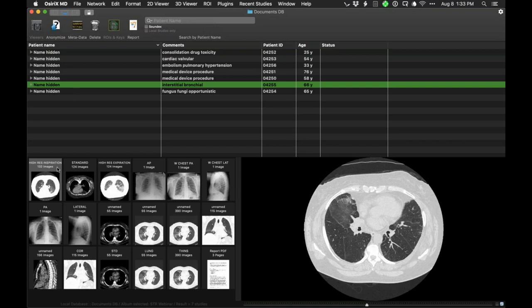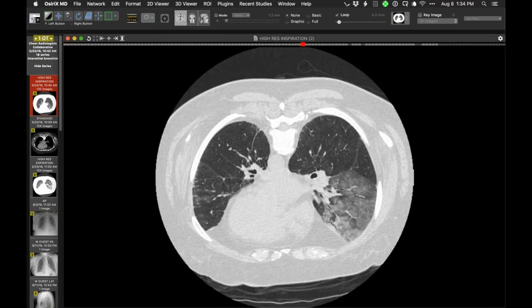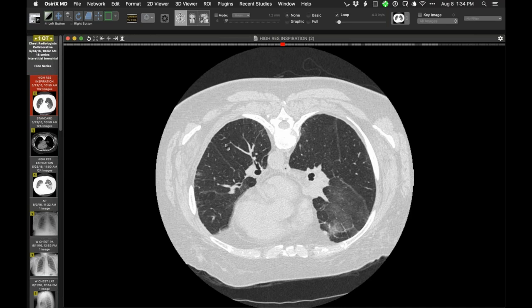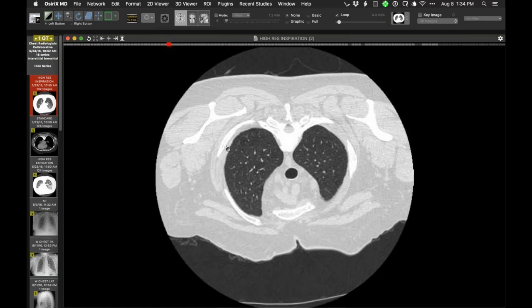Let me start here. I'm going to show you images from 2016 all the way to the current time and tell you initially that by virtue of the patient's history, which was predominantly that of a very troublesome and productive cough that started quite some time before 2016, it's been going on for a long time.